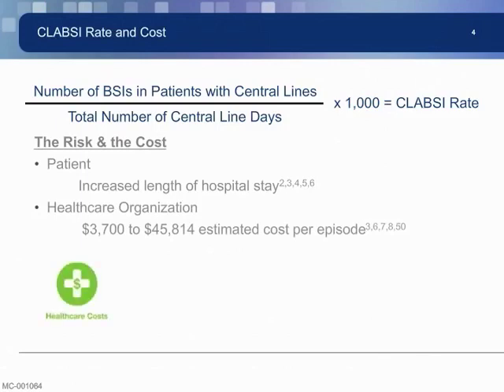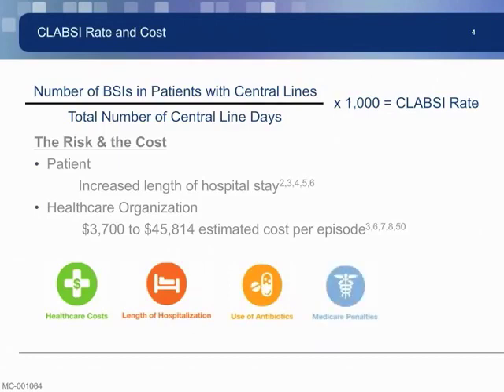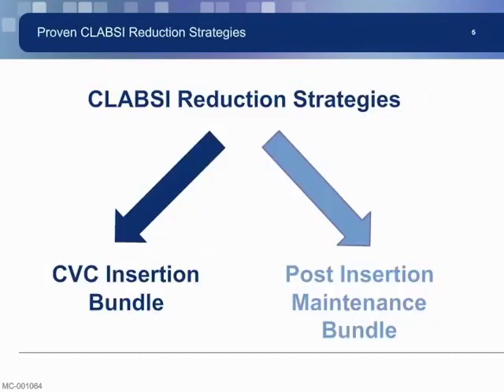Under the Affordable Health Care Act, CLABSIs are a core measure in value-based purchasing and a penalty under the Hospital Acquired Conditions programs. CLABSIs can cause a significant loss in reimbursement from CMS. Two proven CLABSI risk reduction strategies include the CVC insertion bundle and the post-insertion maintenance bundle. We will now review these two strategies in detail.